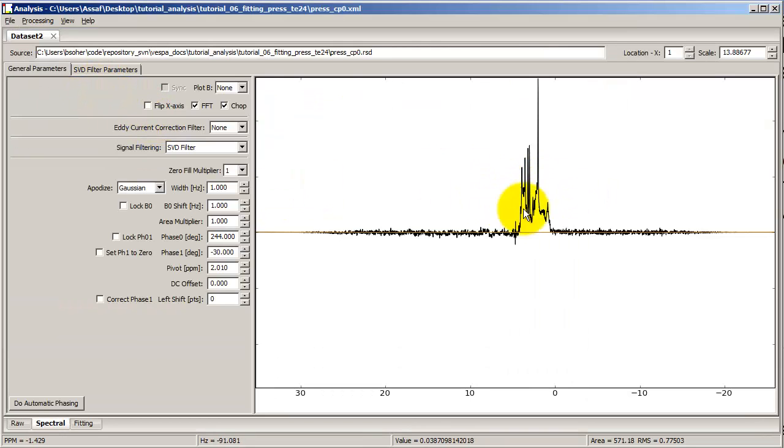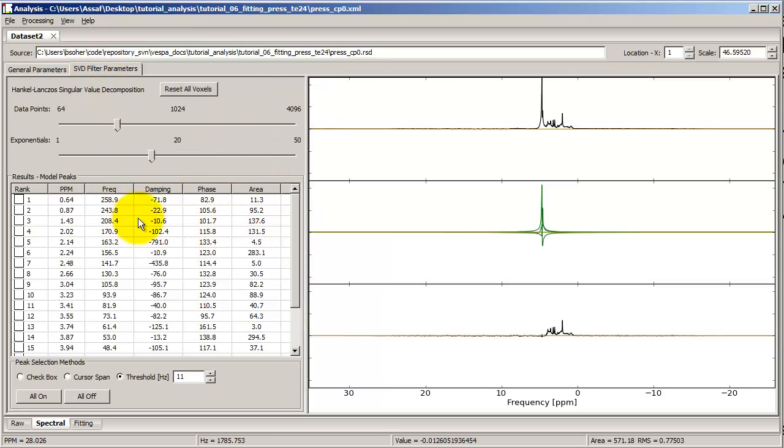and here's this data. It's a single voxel dataset, and as part of the Spectral fitting tab, we have a sub-tab called SVD filter parameters. And this is the SVD filter. Now, this is mainly used for suppressing unwanted peaks in your spectra as part of their pre-processing. Let me show you how it works.